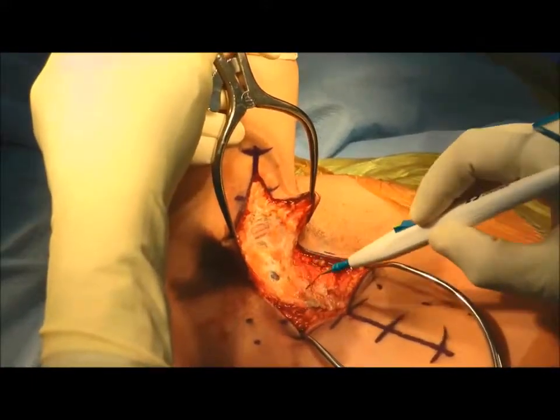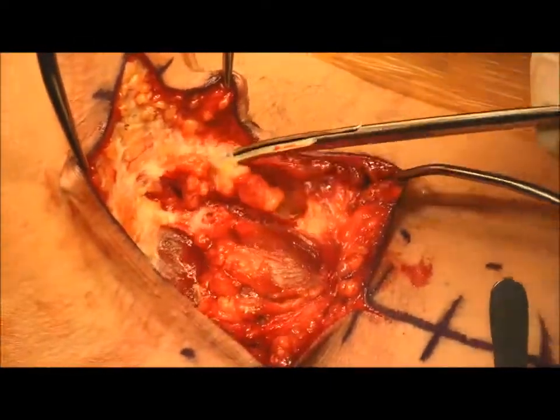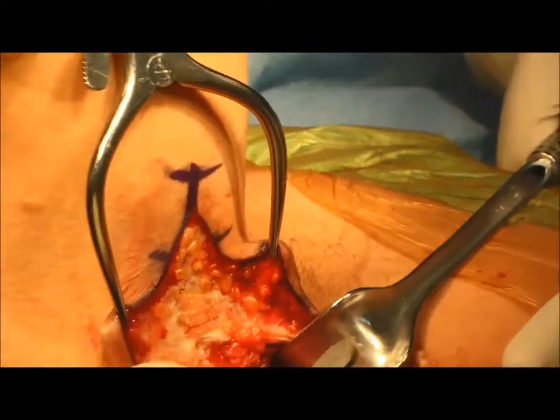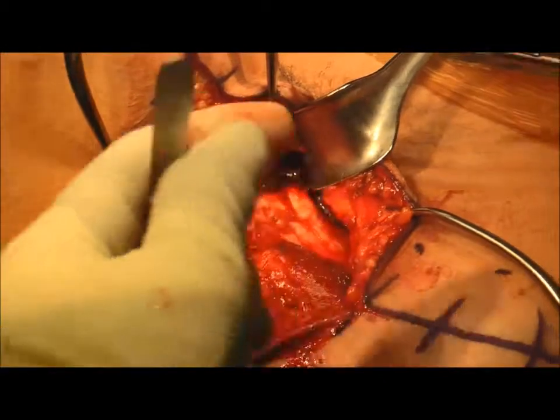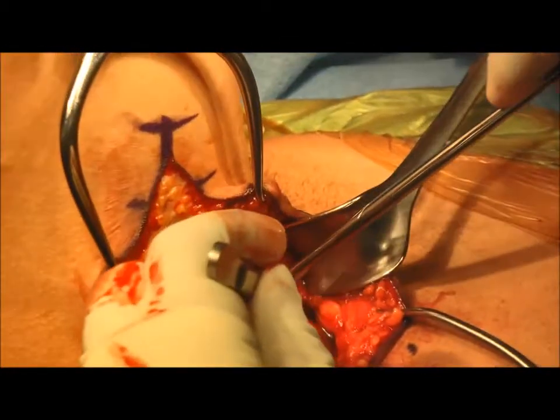Gelpi retractors are used at both ends of the incision to tension the soft tissues as dissection continues. A mixture of sharp and blunt dissection is used to identify the latissimus and teres major musculotendinous complex, which oftentimes can converge into one tendon prior to inserting onto the humerus.